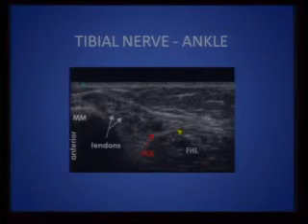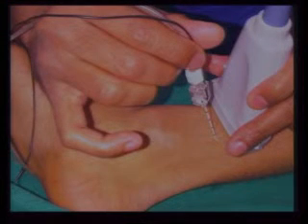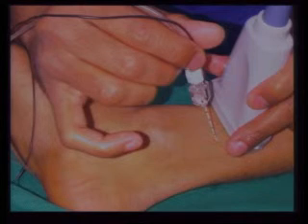There are some times where you have a lot of cellulitis which spreads well above the ankle. And there are patients in whom there is severe peripheral vascular disease and you cannot actually palpate the pulsations of the posterior tibial artery. And in such instances, an ultrasound is very useful to pick up the tibial nerve at the ankle. This is how you use the transducer. You place it in short axis. The needle always goes out of plane. That way it's much easier.